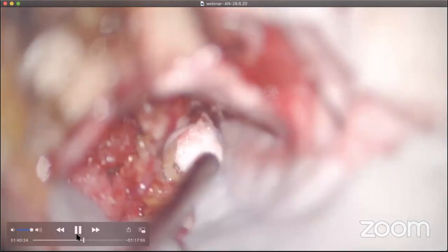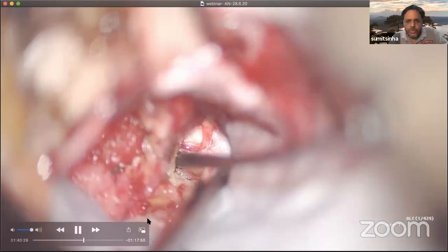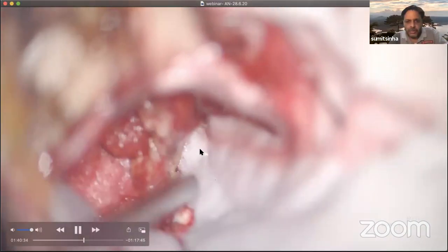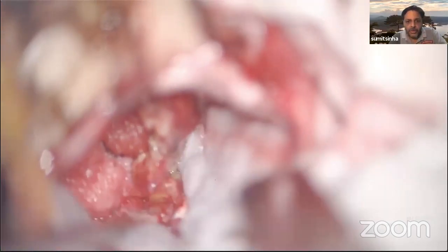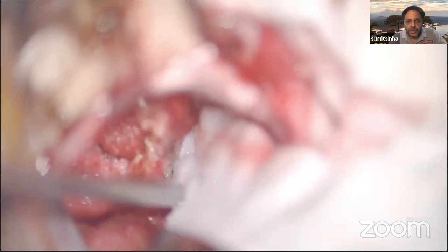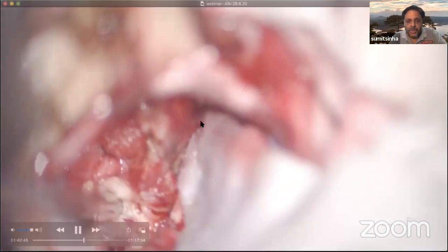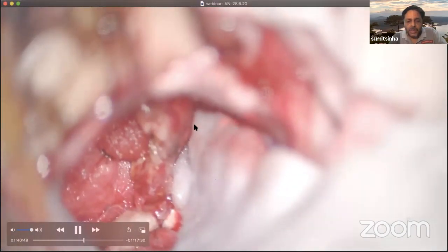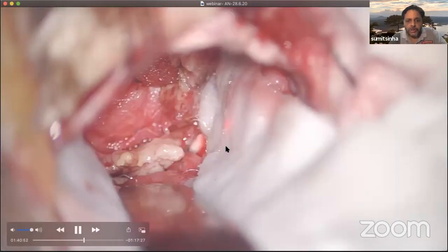Yes, I can. So this is the most important step. I'm about to localize the facial nerve here at the lower pole, and it's giving me the potential over there. So the facial nerve is somewhere near the vicinity. I have to be very, very careful while dissecting over here. From now on, I've got the first clue as to where the facial nerve is at the distal end, probably at the lower pole of the tumor. So I have to be very careful at this point.